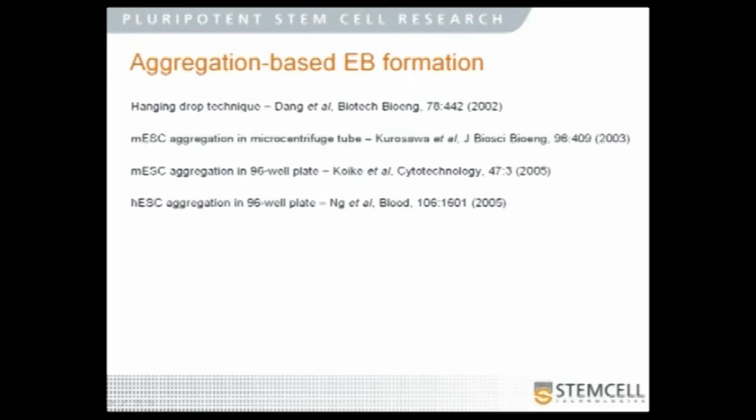And one point that I and others I've talked to about this have encountered is it turns out to be somewhat technically challenging to perform this forced aggregation reproducibly with human ES cells. I was fairly lucky when I first started the process. The first couple of times I did the experiment, aggregate formation occurred successfully. And then we went away over the Christmas break, and when we came back in January, nothing was working. So I spent quite a bit of time, first of all, trying to recapitulate my own earlier results, and then trying to determine why it was that the protocol that had previously been working had stopped doing so.